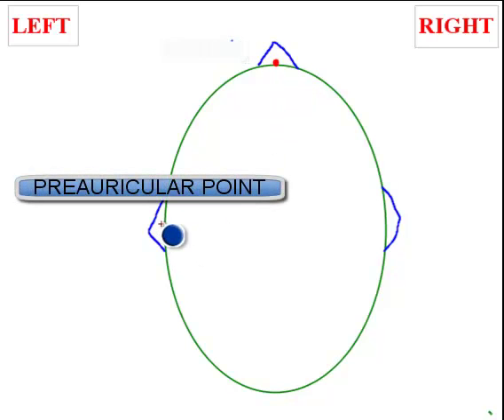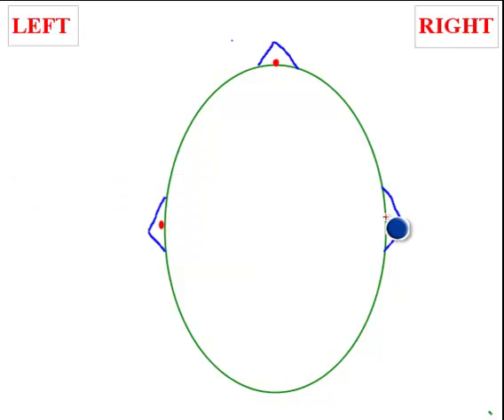You identify the two preauricular points, these are right in front of the tragus, in front of each ear, and you identify a bony landmark called inion, which is somewhere around here.